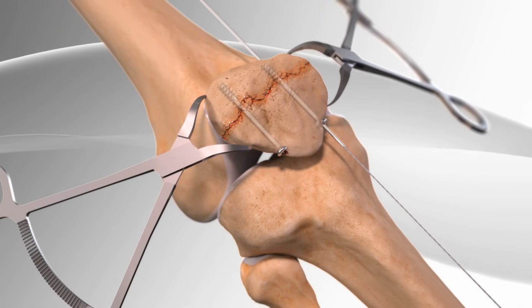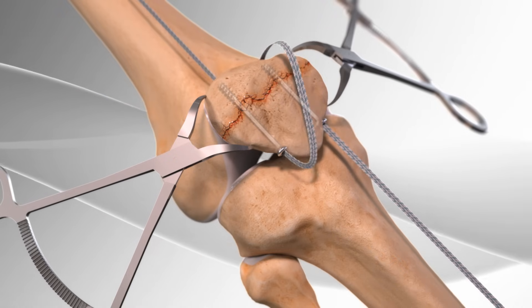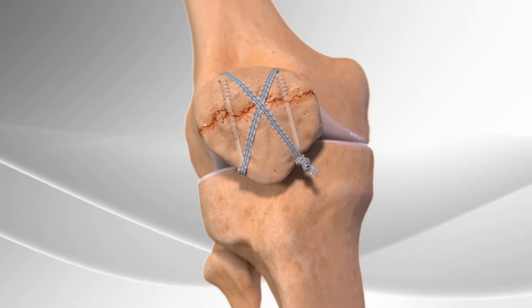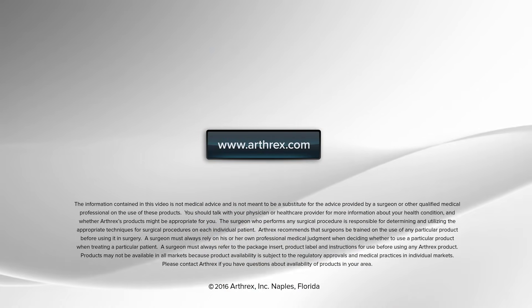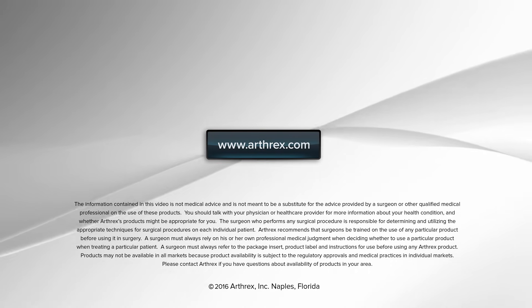Sutures are placed through the screws to make a figure-eight pattern over the patella, holding the bone structure together. This completes the repair of the patella.